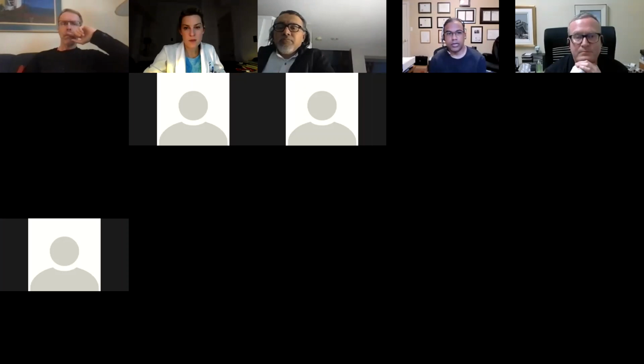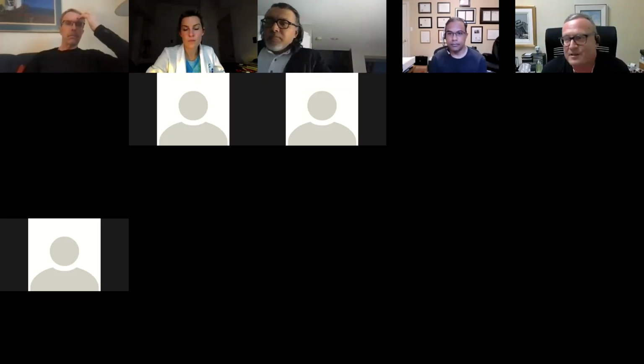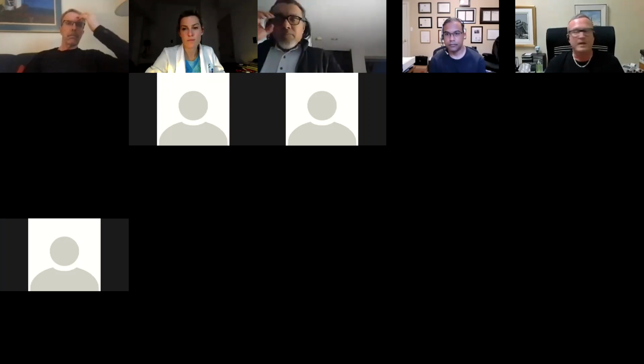Okay. Francois, I don't know if you have anything to add. Are you doing a lot of left bundle pacing? We're doing more and more. I think we had the same challenges as the one you discussed, being too high at the beginning. That was probably my first mistake, going too high, because the sheath wants you to go too high, because I don't think we have the perfect tool yet to do it.